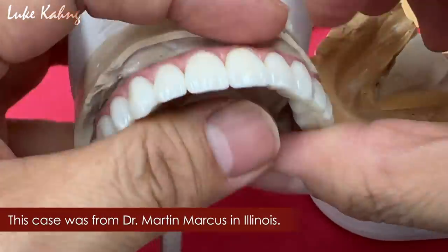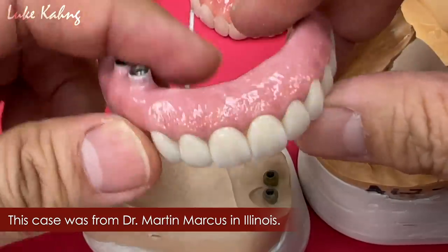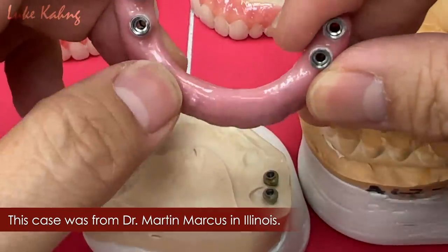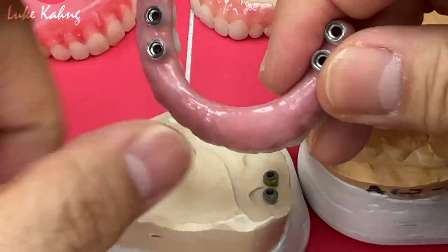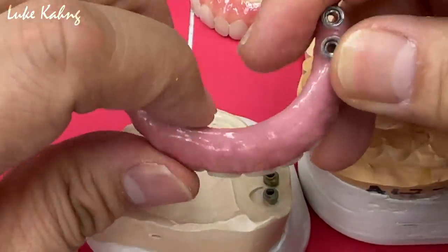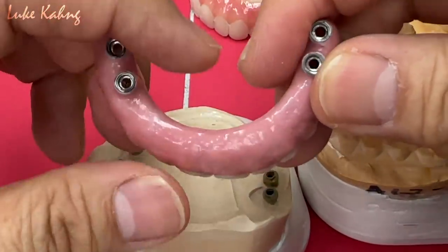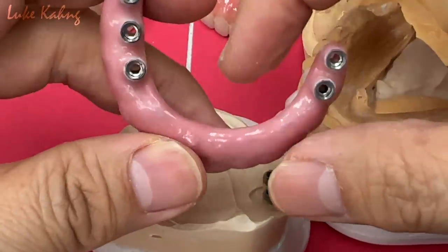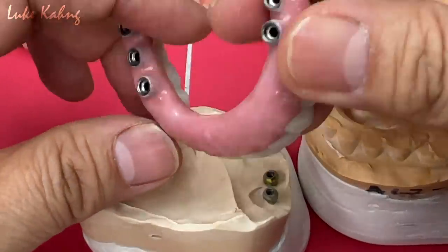Just happy to send it out to Chicago. The doctor's name is Martin Marcus. The reason why we made this, let me repeat one more time, cannot find implant. So the doctor cannot place implant. Unfortunately, we have to make a bigger one, but zirconia is not going to work because if I make zirconia, I have to make it really thick this much, which people don't like.